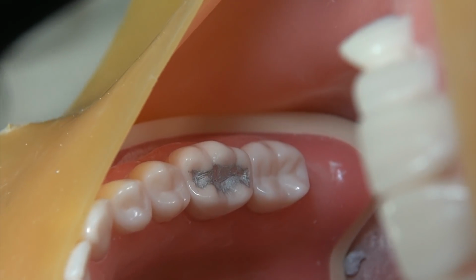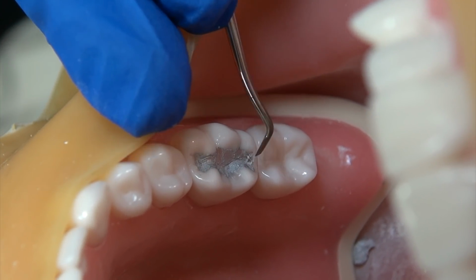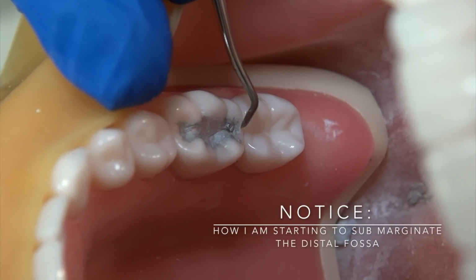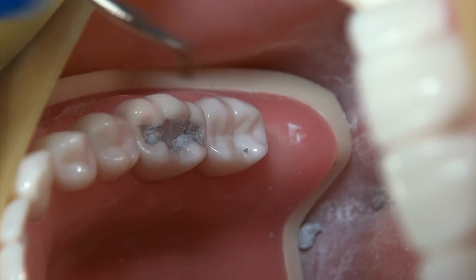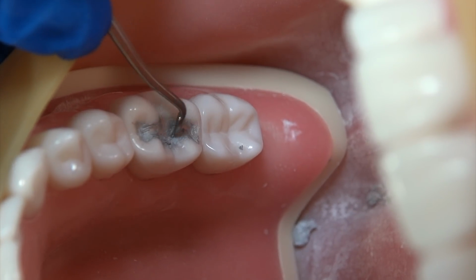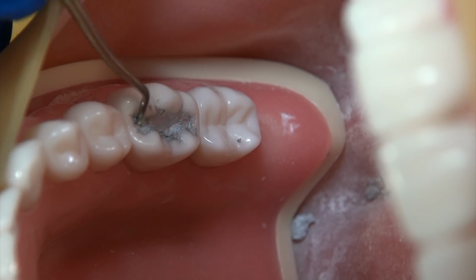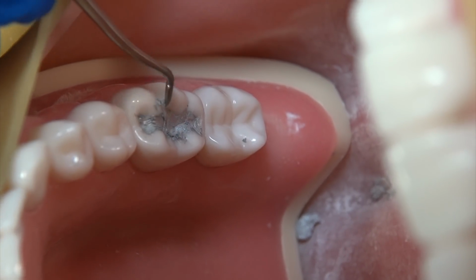See how nice that is? Now I'm going to do the other side with the discoid. Now, this distal fossa is an easy place to lose and submarginate, so you really have to be extra careful not to remove too much. And this I like a little bit more for going into the grooves, into the area, making sure I'm creating that anatomy.